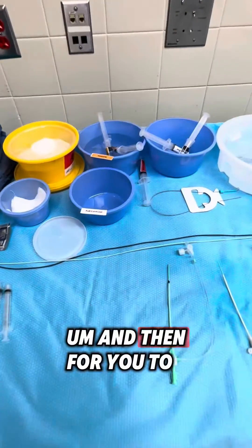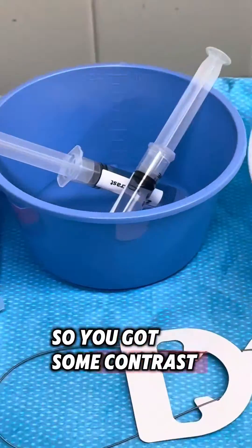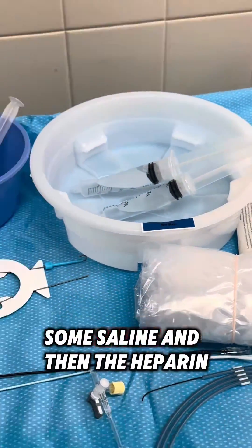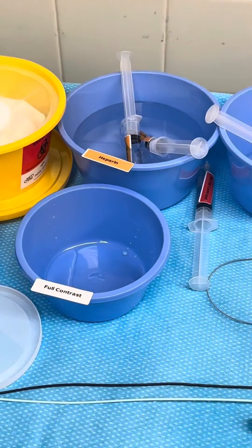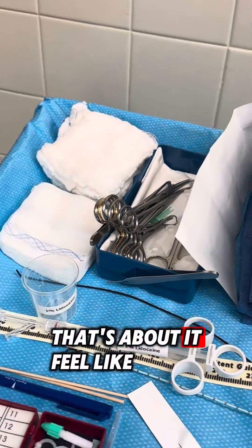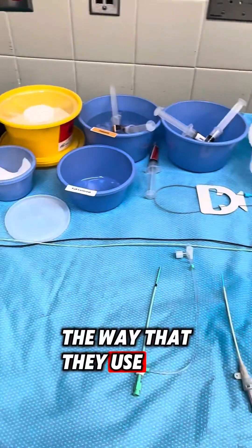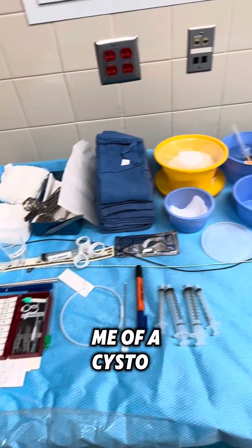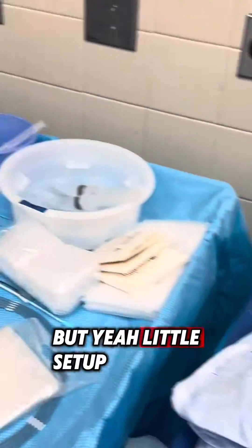To be able to see when you do the x-ray, you use contrast. So you've got some contrast on the table, some saline, and then the heparin. Really, that's about it. I feel like vascular is pretty easy, honestly — the way they use wires and catheters sometimes reminds me of a system. Just a little setup.